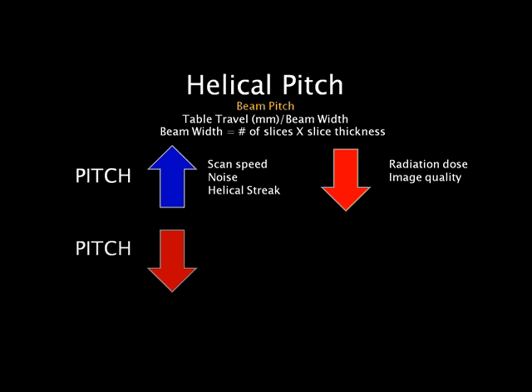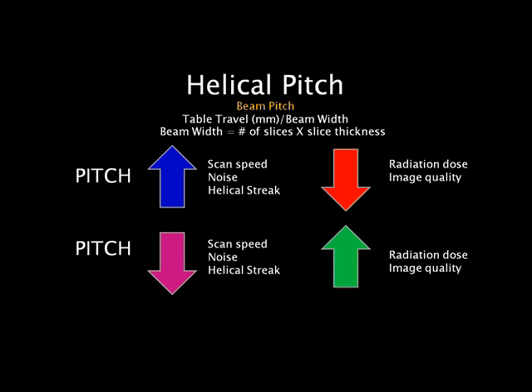If you decrease pitch, you're going to decrease the scan speed, noise, and helical streak. It comes with a higher radiation dose, but you're also going to increase your image quality.